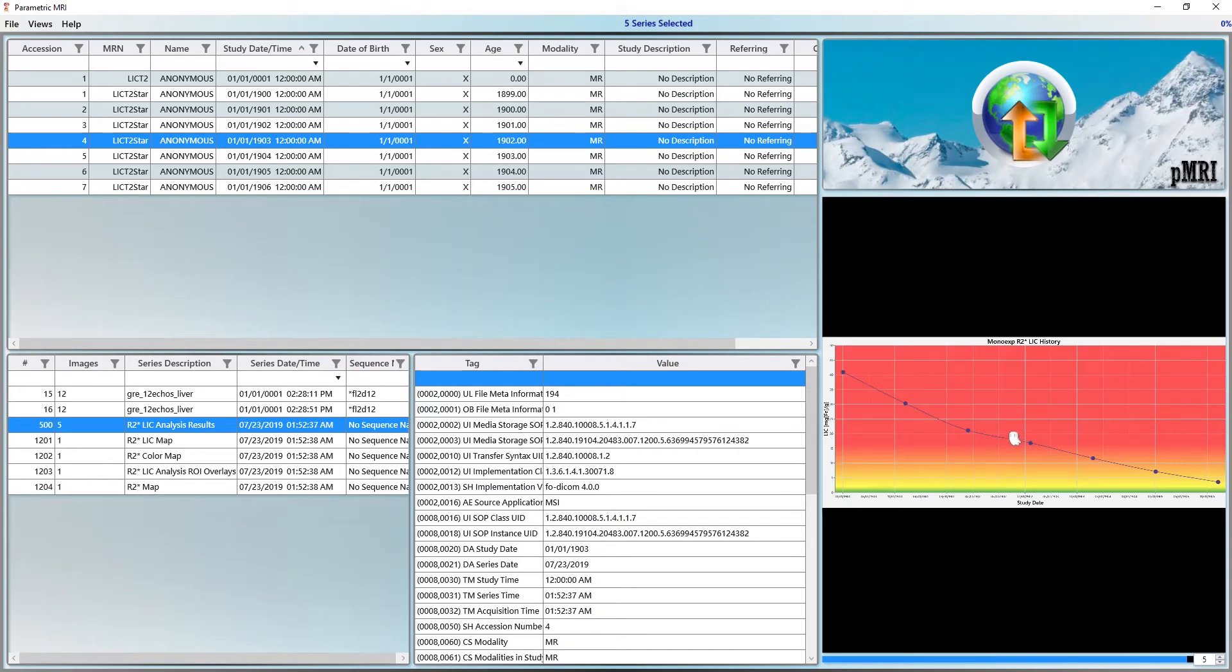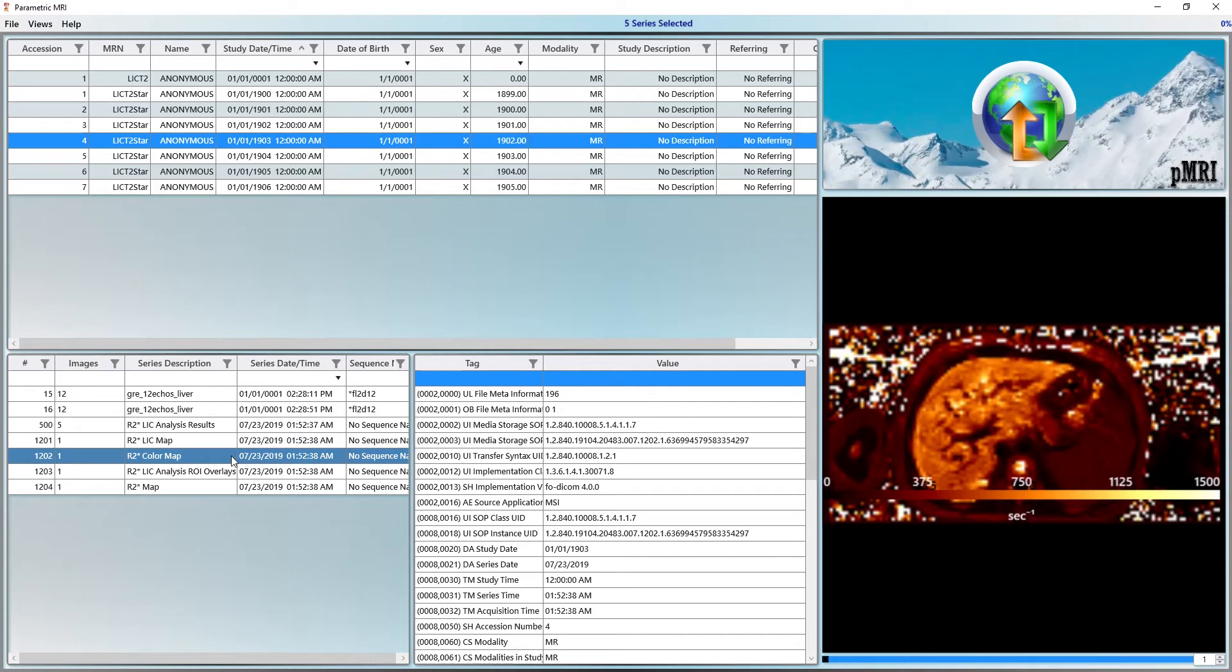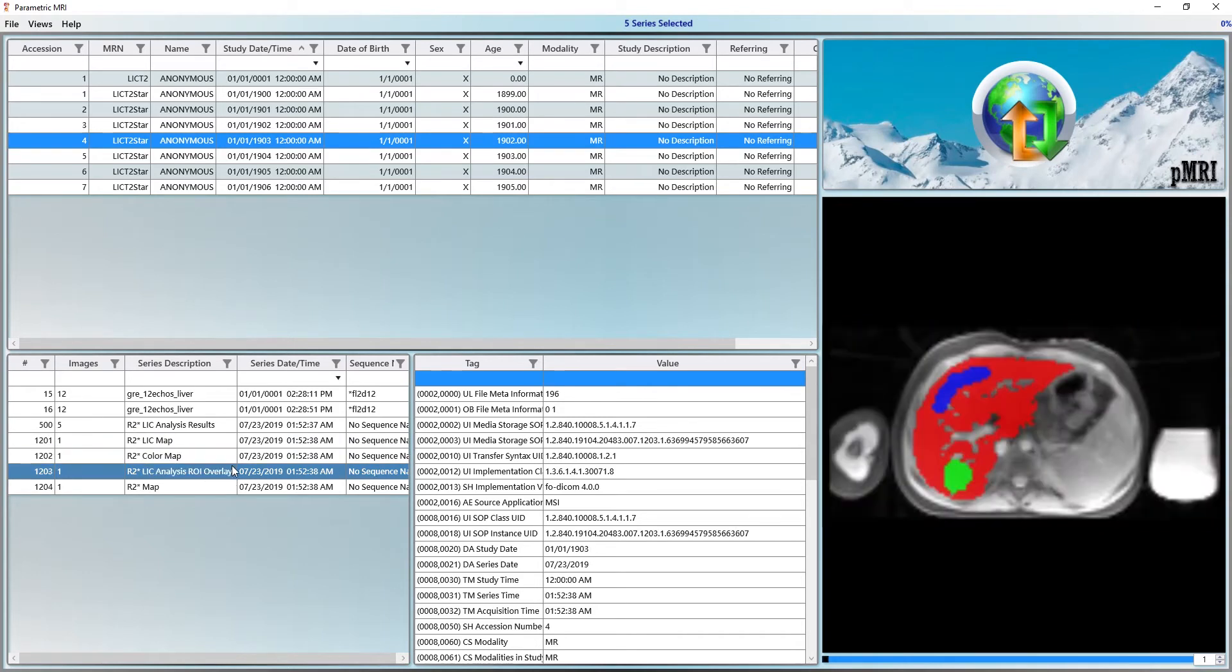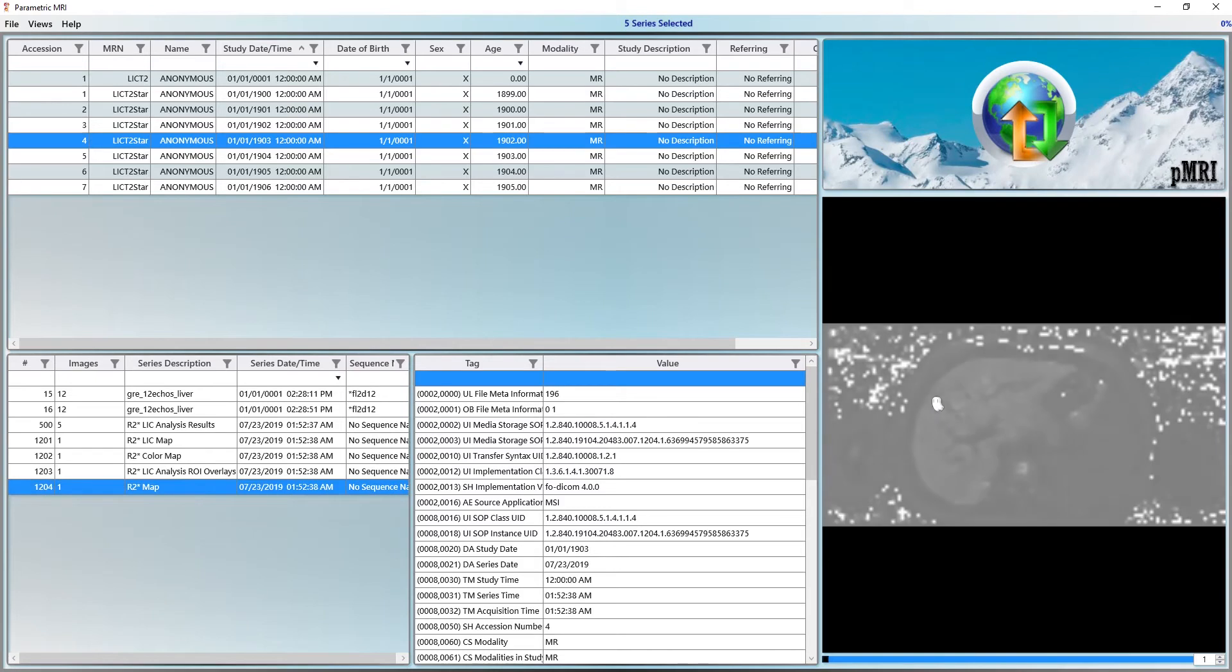The next series is a color LIC map followed by a color R2 star map, ROI overlay screenshots and a grayscale R2 star map. Let's look at each one of these in more detail.